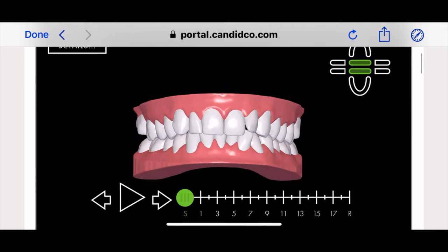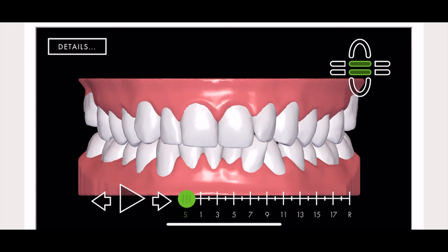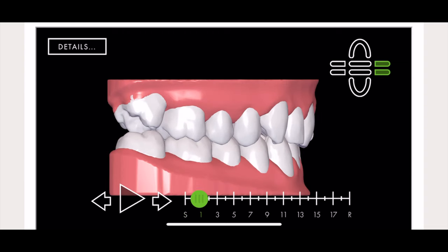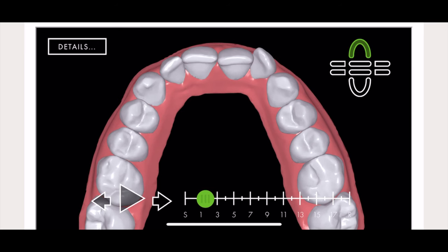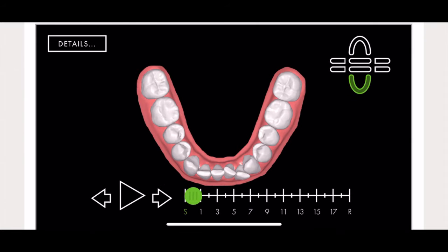What we're seeing here is the 3D mock-up that Candid sent me so I could look at what my teeth are going to do over the course of the program. Sliding it to about where I am now, you can see the areas already starting to change. You can turn it to see one side versus the other — this side doesn't show a lot of change, but on the other side there's tons of change already happening. As we continue through the program I'll use this to show you what changes should be happening. You can see the front teeth on one side starting to shift, and the same on the bottom.